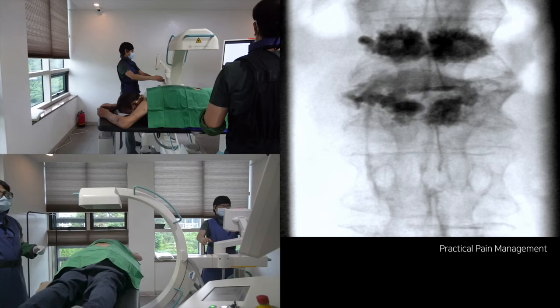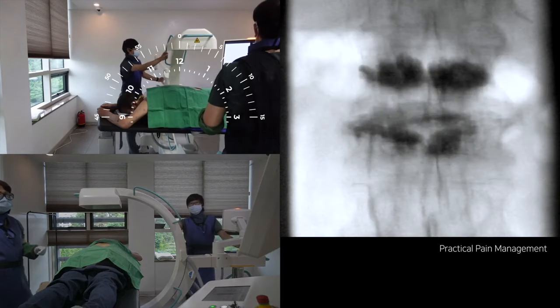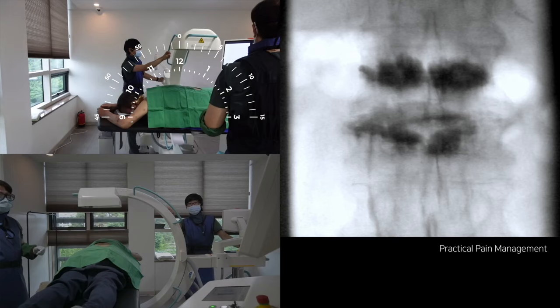Please check the cranial tilting and rotation in each procedure. The patient underwent percutaneous vertebroplasty at L1 and L2 with compressive deformities. I will show performing transforaminal epidural steroid injections at both L2 levels. It is an AP view without rotation or tilting.